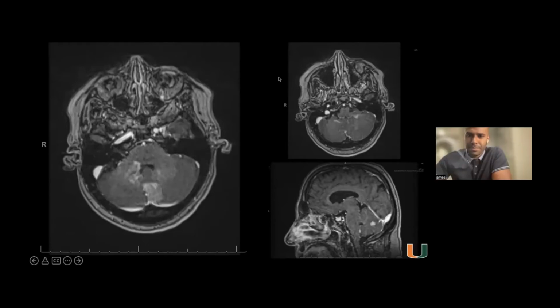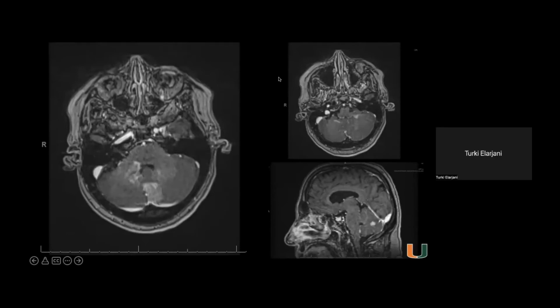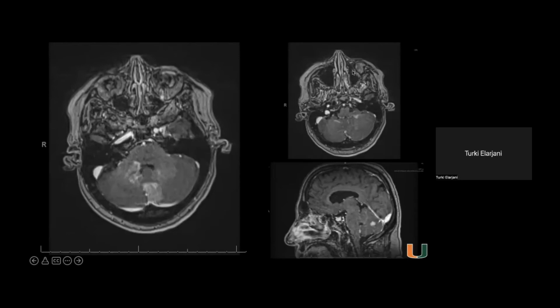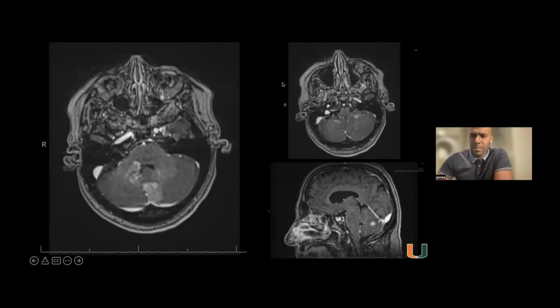No. Okay, so the double vision could be explained by an abducens nerve palsy, given the close proximity to the nucleus on the right side. I don't see any other lesions, just the cerebellar lesion. Yeah, exactly. There are actually a few cerebellar lesions, just like you mentioned.